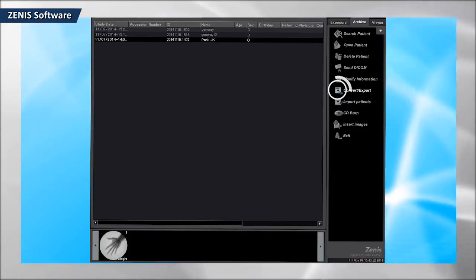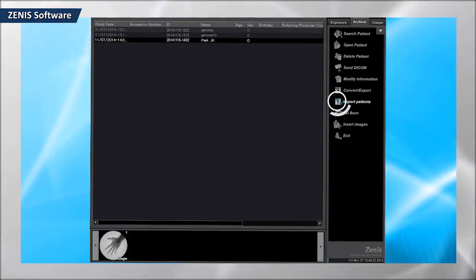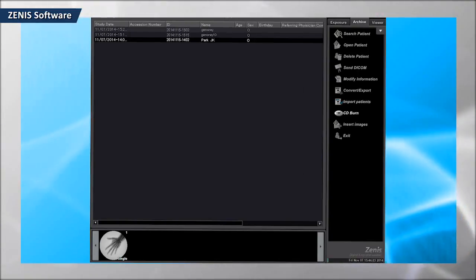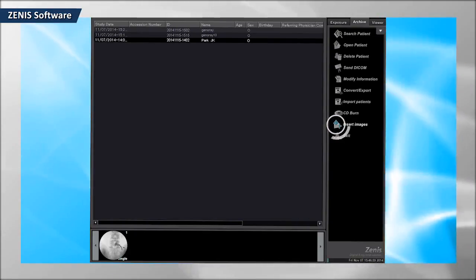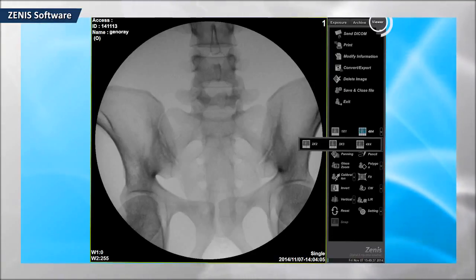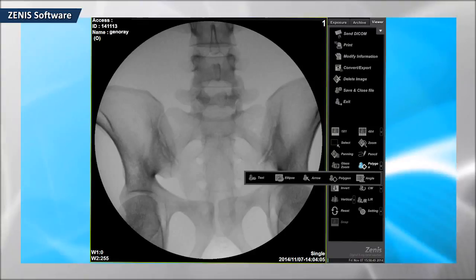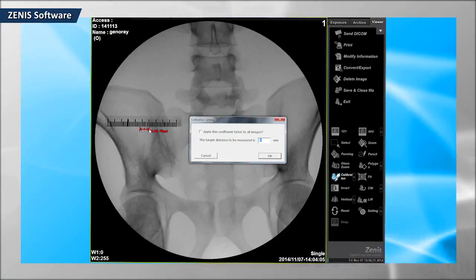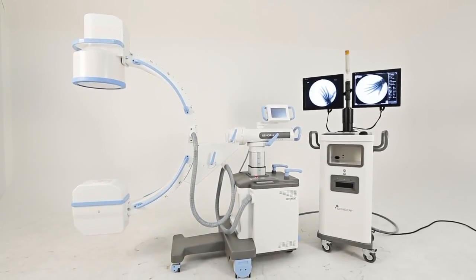The selected patient's image and information can be saved in a file by clicking on the external store function. Make use of the external input function when importing backed-up patient information and images. An image can be burned onto a CD. An additional image can be saved on pre-existing patient data storage. It automatically moves to the video watch tab when you import an image. You can make use of a toolbox at the video watch tab, which has various functions to allow detailed analysis and controlled images — use according to appropriate circumstances. High Performance Surgical C-Arm.